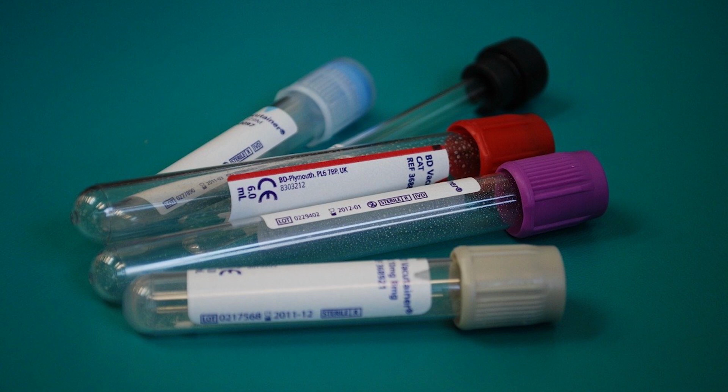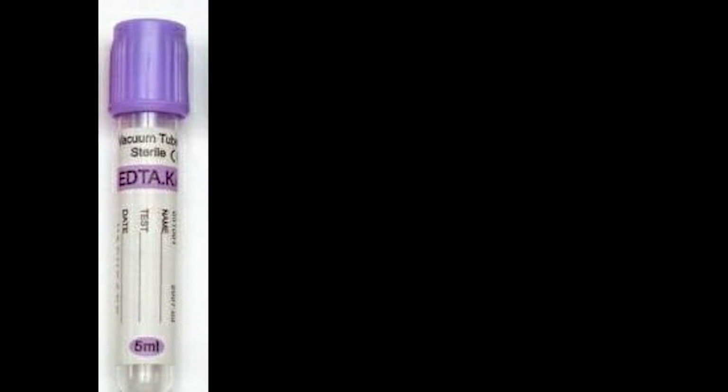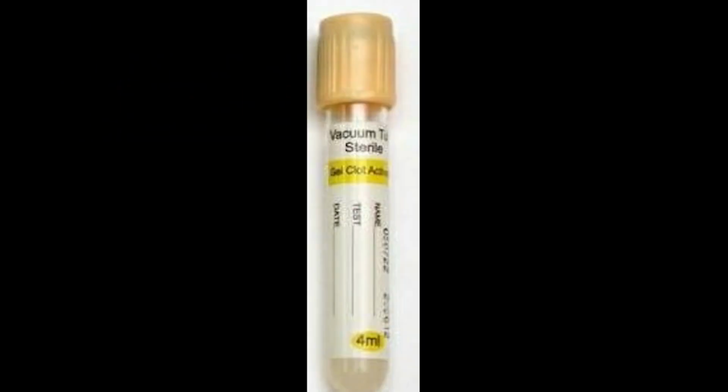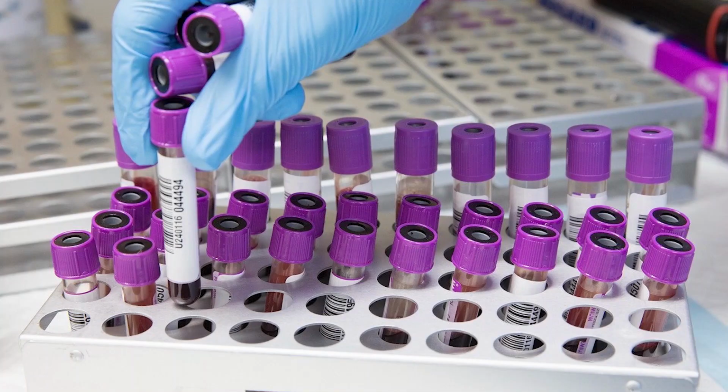Sample contamination chances are there between the sample collection tubes. Chemistry sample collected after potassium EDTA. The increased level of potassium available in the lavender tube can contaminate the chemistry tube.